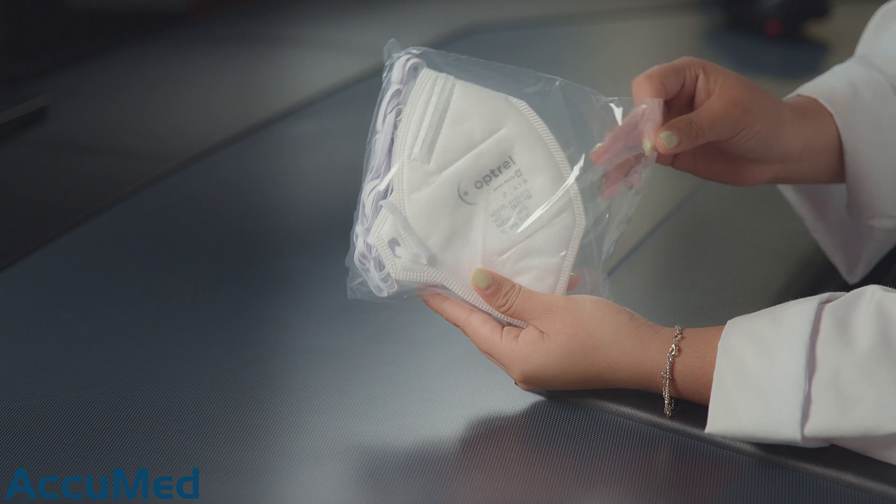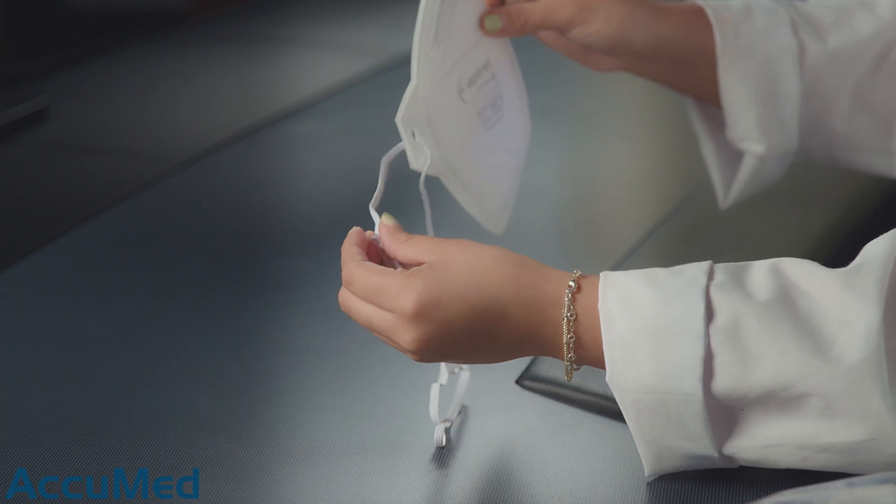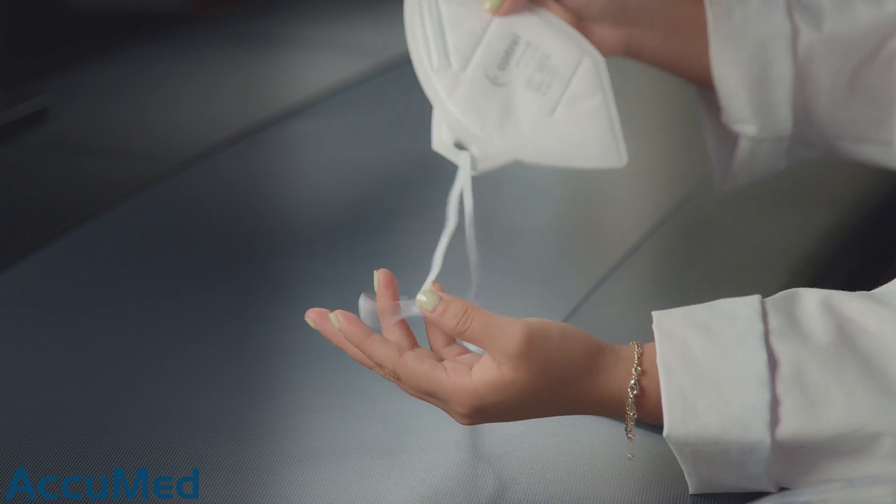They do come packaged in fives, so this is how they look. They have one long continuous headband and a very stiff nose wire, which usually is a good thing — however, sometimes it's actually hard to frame it to your face, so we're going to see how this works.